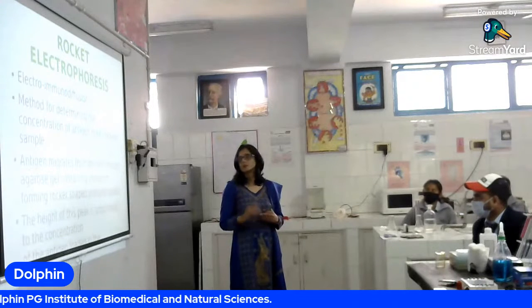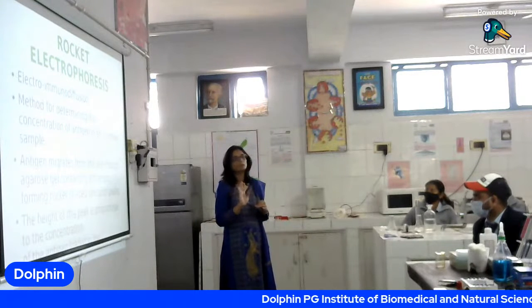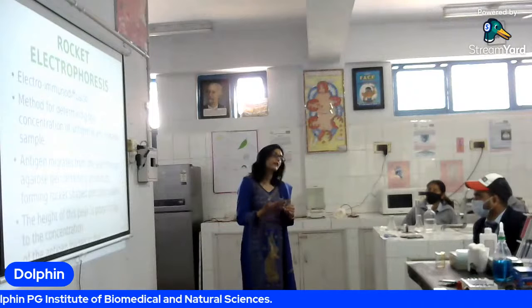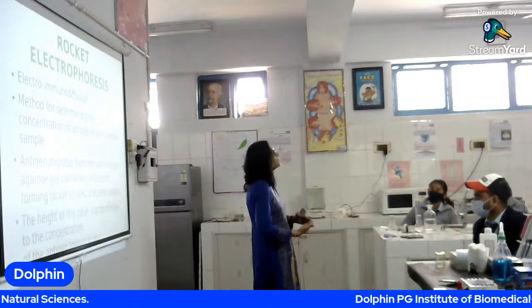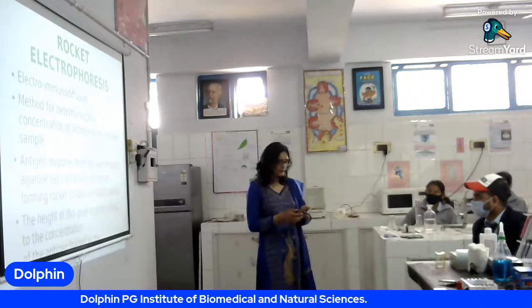That is proportional to the concentration of the antigen. ठीक है, तो एंटीबॉडी का कंसंट्रेशन वेरिएबल नहीं है, वो फिक्स किया हुआ है हमने। एंटीजन वेरिएबल कंसंट्रेशन में है, कितना एंटीजन है उसको हमें निकालना है। कैसे निकालेंगे? हमने पहले रॉकेट बनाया, फिर हाइट ली और उससे हम क्वांटिफाई करेंगे.